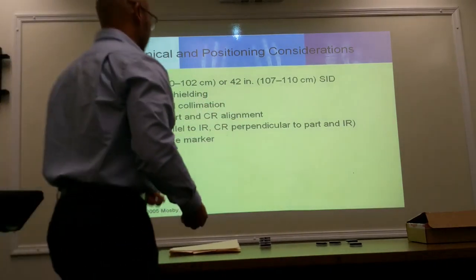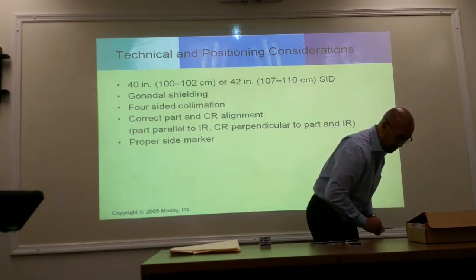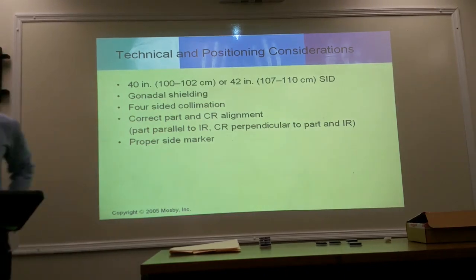Just pass that around. And I think if you buy them in bulk, they're cheaper, right? So buy like a set of 50. How do you get them personalized? Yeah, I think you can buy them in bulk, so they're cheaper. There's like a set of labeling markers also, for supine, lateral, all that. Is that worth investing in later? Probably not. Because on a computer, you can do that.